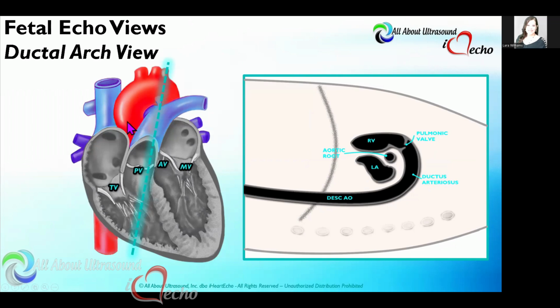If you imagine underneath here, this is the aortic valve, right? With the aortic valve coming under, that aortic root kind of comes down in here. So we do catch a piece of it there. We're also going to catch a piece of that left atrium back behind here. Imagine this left atrium doesn't end here. It does go underneath there. So we would catch a piece of that left atrium as well.